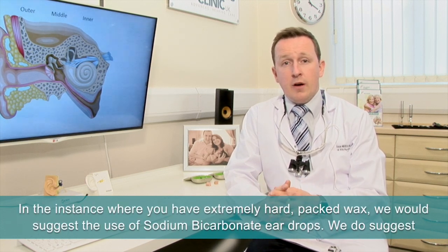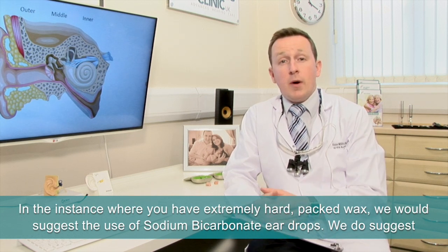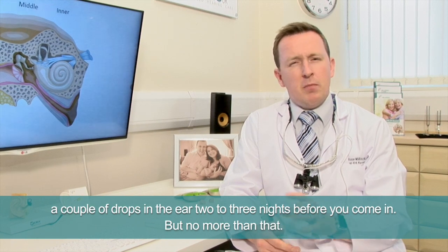In the instance where you have extremely hard packed wax, what we would suggest is the use of sodium bicarbonate eardrops. We suggest a couple of drops in the ear two to three nights before you come in, but no more than that.